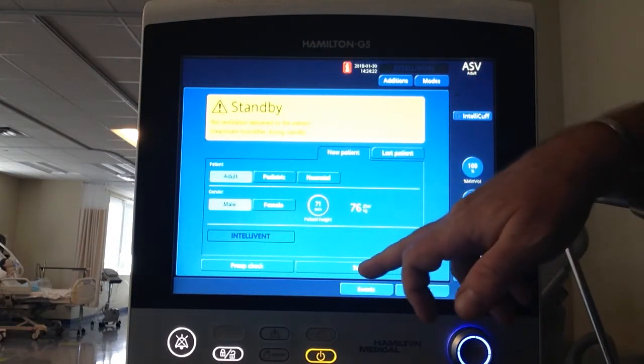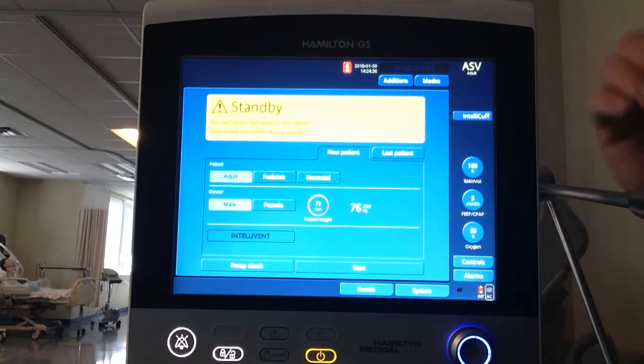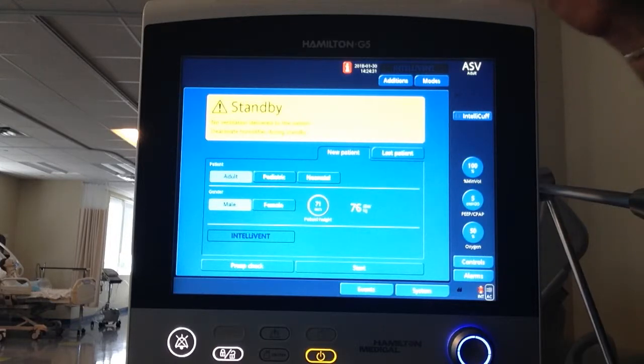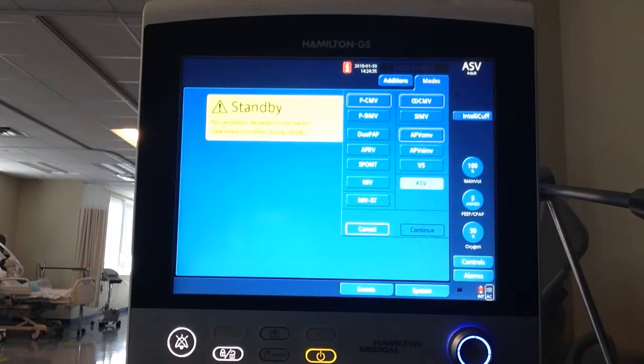I can either hit Start and begin ventilating, but I don't have my settings in yet. Let's say the patient is still being bag-masked, so I want to go into Modes first. This is my modes screen.